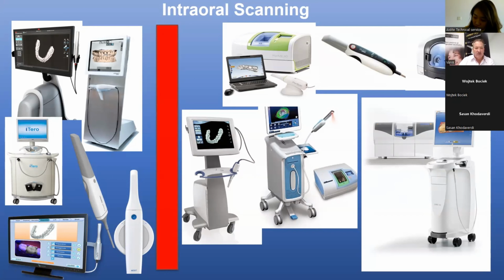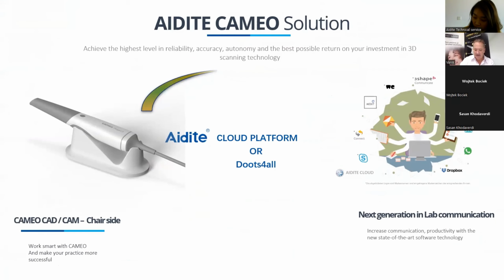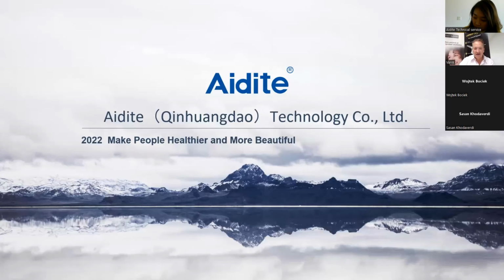For you to know, there are two types. One is intraoral scanning with milling machines, like you see here, chairside versions. The other one is standalone intraoral scanners. We want to talk today about the standalone intraoral scanners because they have much more potential than the chairside units. Okay, let's go on here. I went the wrong direction, sorry.